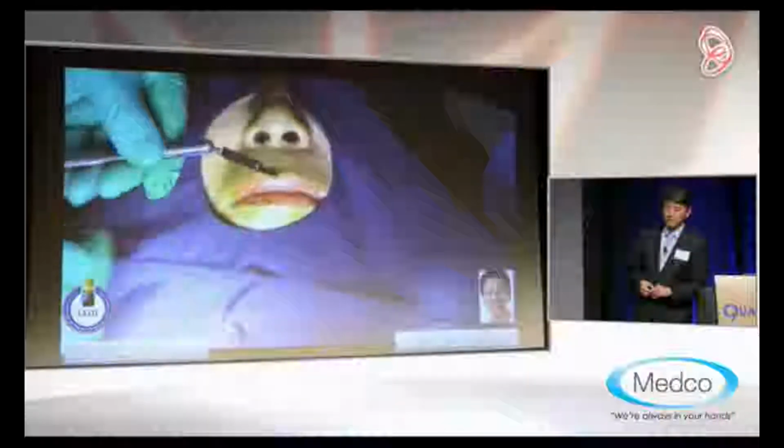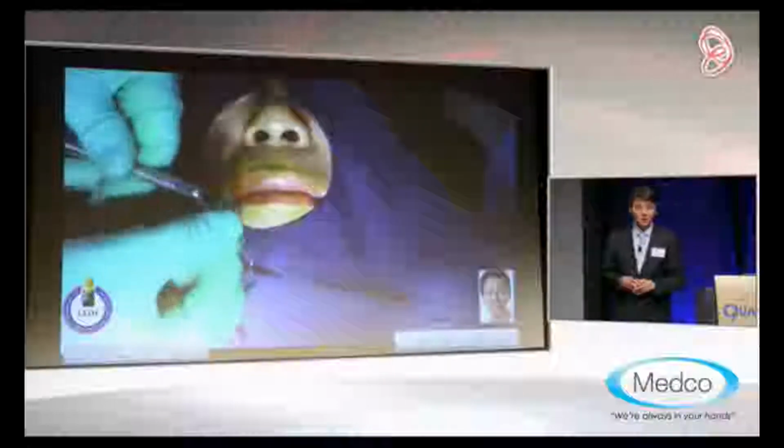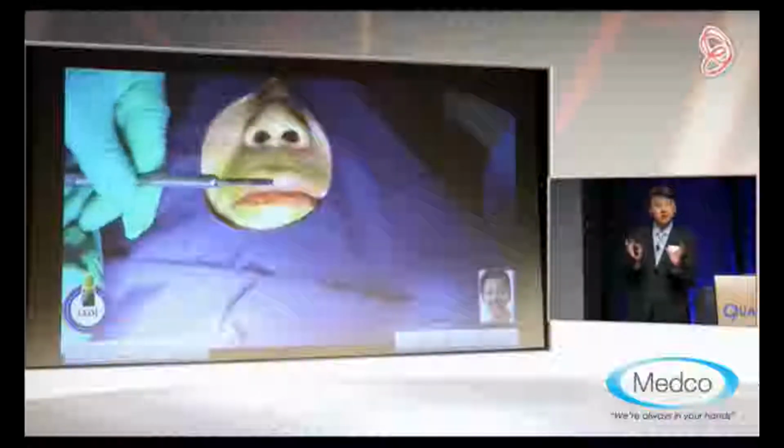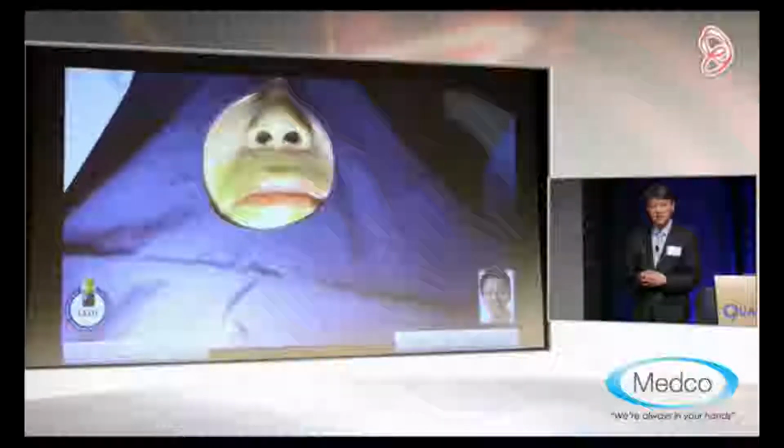Okay. It's very nice. This makes a big difference when you want to harvest this free gingival graft in a very small mouth. Okay. So changing the angulation, changing the direction of the blade is very critical to be a good implantologist.